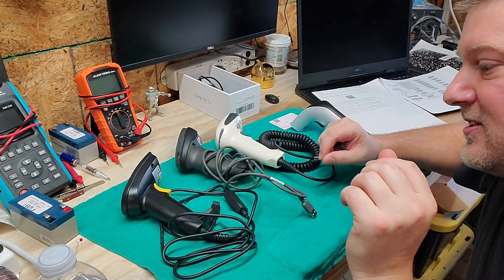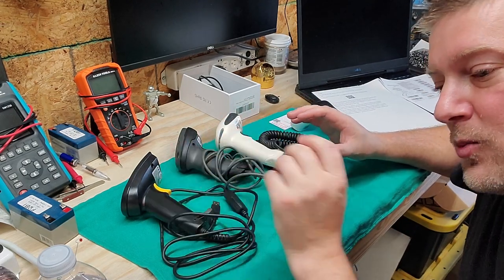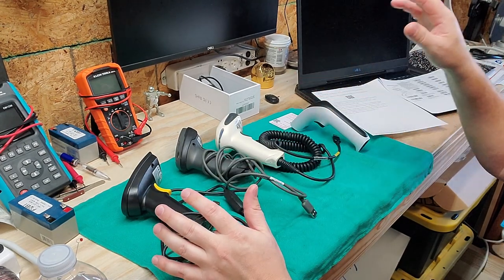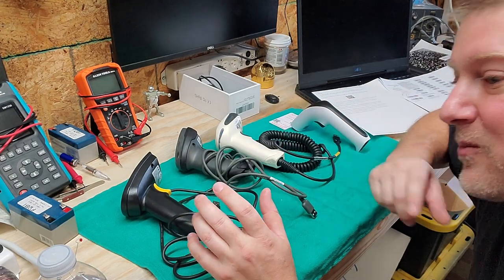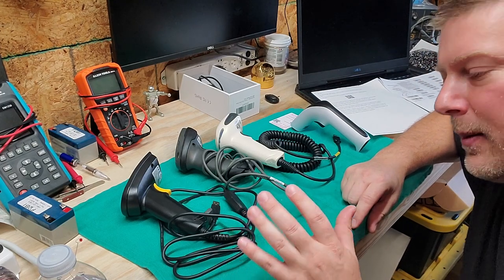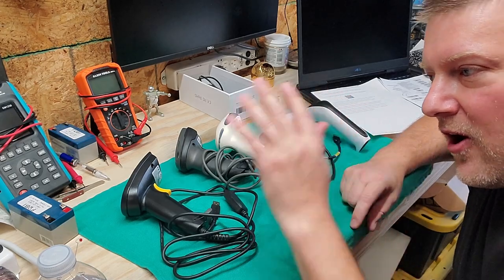Barcode scanners come in different types, so you have to know what you want to scan, and once you know that, you can figure out which one meets your needs. If you don't have one available, you might be able to make one available, because some medical equipment barcode scanners are programmed and we can deprogram them so they can read all types of barcodes.